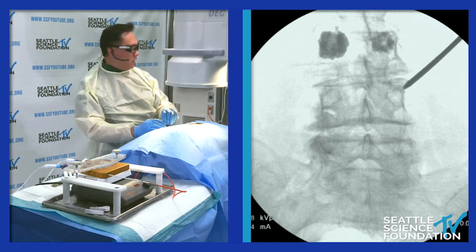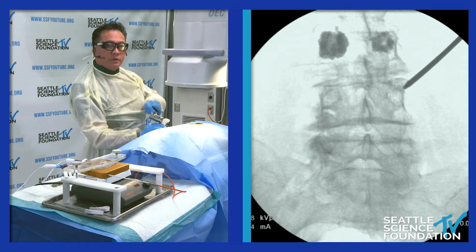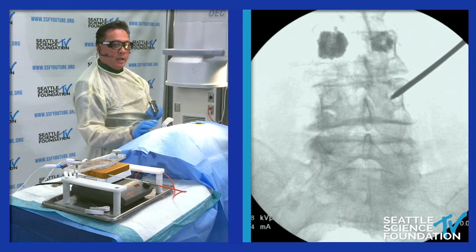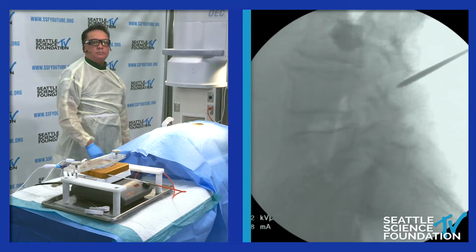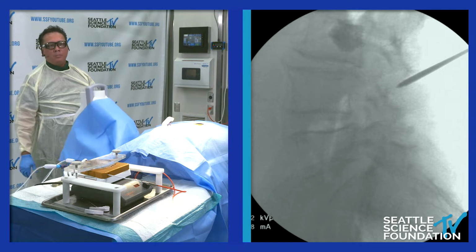No, well, you know, in spinal we're accessing the pedicle quite a bit differently. So this is a 2 o'clock approach. Exactly, I'm not meeting the medial pedicle line. Let's go to a lateral now. You didn't like Yev's 3:30 approach. You wanted to go 2 o'clock. Yeah, 2 o'clock, approximately.